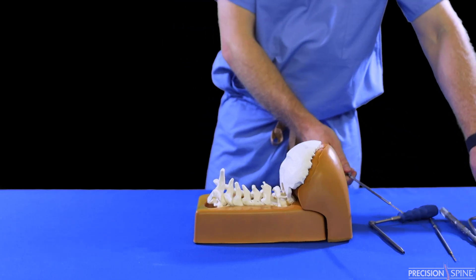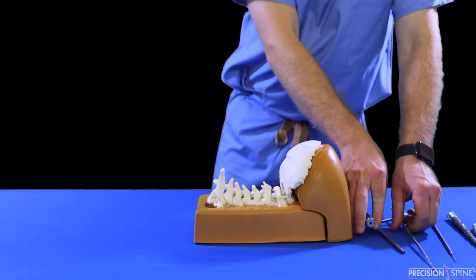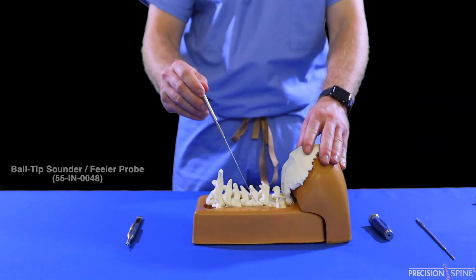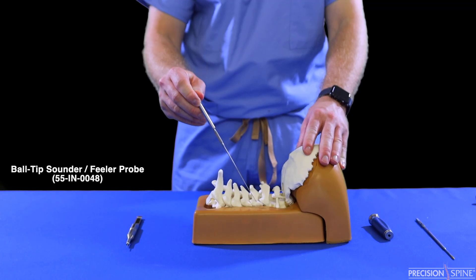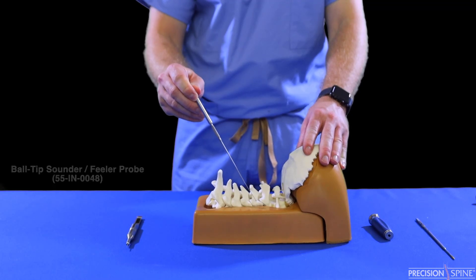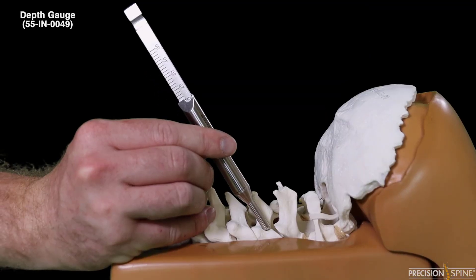All drills are 1 mm undersized in diameter. Next, verify the integrity of the pathway created by the drill with the ball tip sounder and verify the depth with the depth gauge.